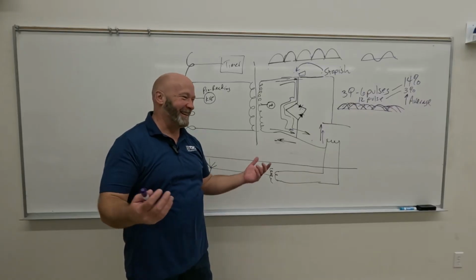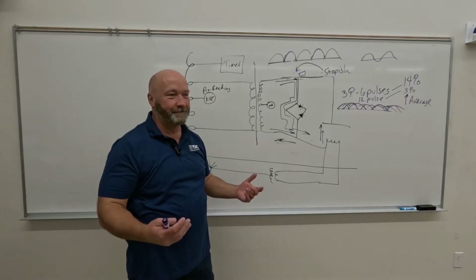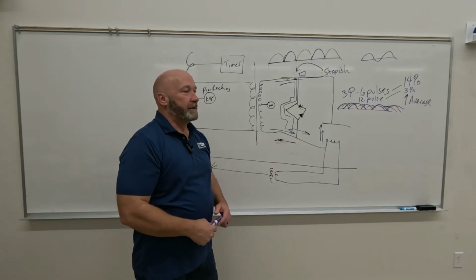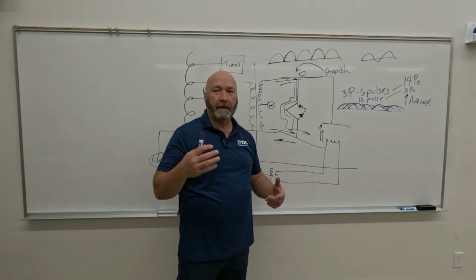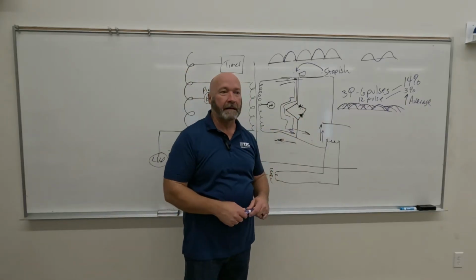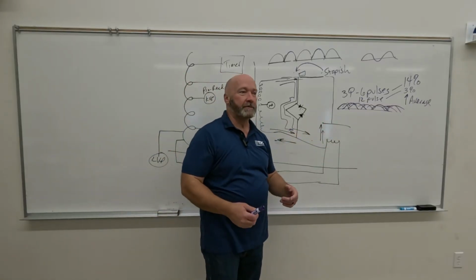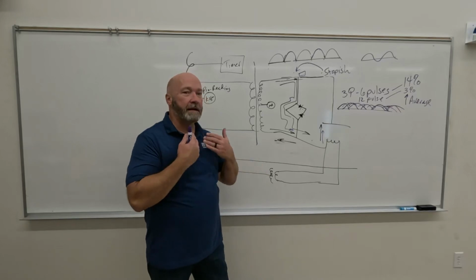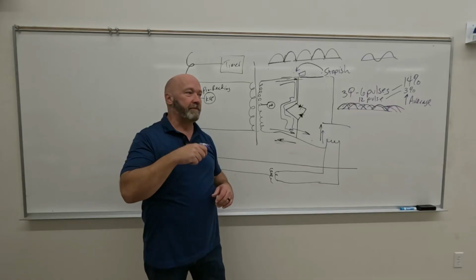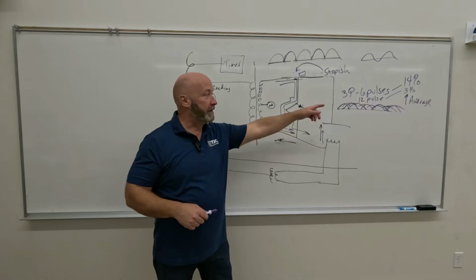Okay? Yeah, I know. You look like you just smelled Limburger cheese. Yeah, it's 2. It's a factor of 2. Okay, so what's a practical application for this? Let's say you're working in a clinic that has a 3-phase machine and a single-phase machine side by side. And you make an exposure on a 3-phase machine. Let's say, since we just covered C-spines, you're shooting an AP axial C-spine, and you used 75 kVp at 12 mAs on the 3-phase machine.